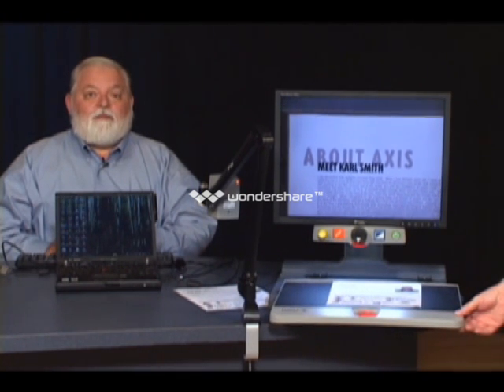They do make machines that have what's called line markers, which will bring up some little lines on the screen or block off the screen everywhere but that line for you to look at. And that's fine. I sell machines with that. But I find the best thing and the easiest way and the cheapest way to do it is simply put the line of print that you want to read right at the bottom of the screen. Use the bottom of the screen as a guide to keep the line straight.